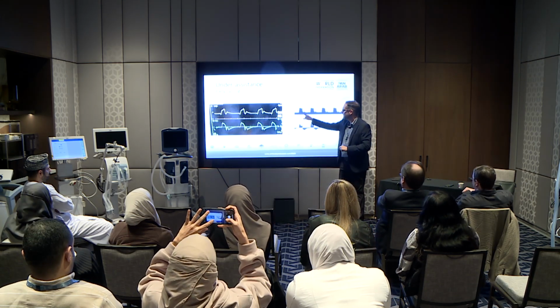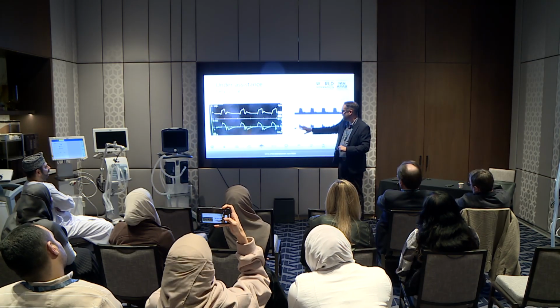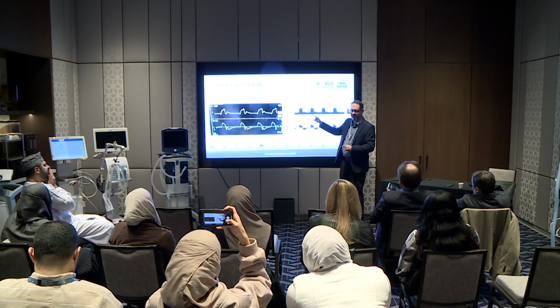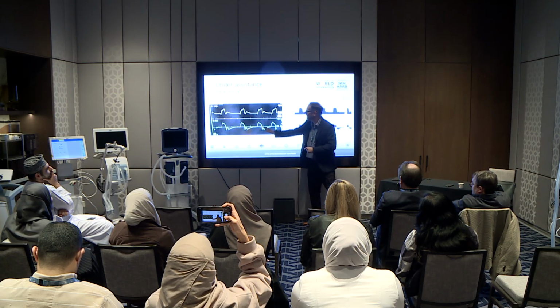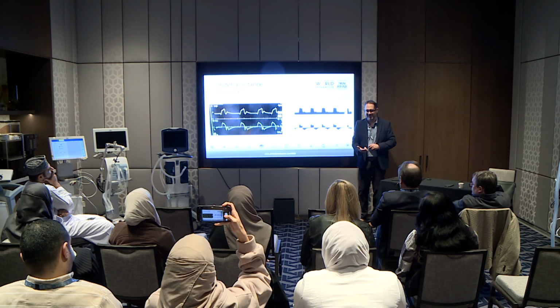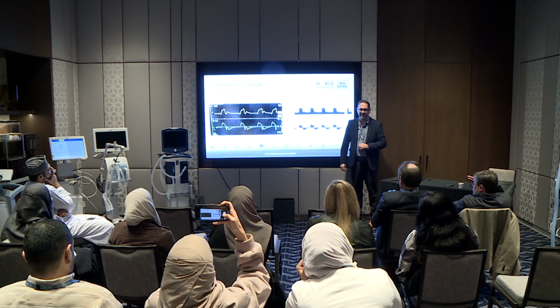This one, there's no evidence of patient trigger. Again, this is pressure control, so if I look at the flow, it goes down as it should and goes back up again. The ventilator cycles off and you have this little blunting of the expiratory flow. So both of these could be examples of early cycling, but this is where it can confuse you sometimes. You might call this early cycling, and you miss the fact that they didn't trigger the breath.